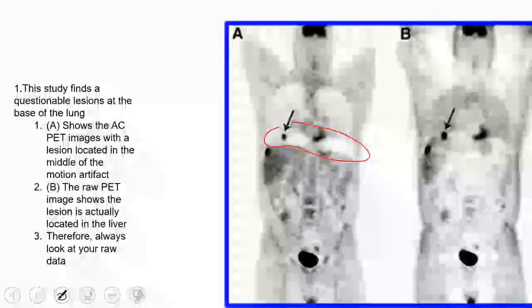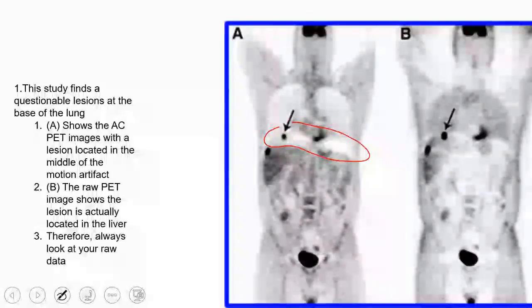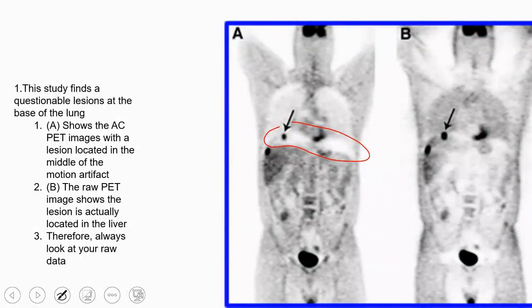There are some problems that affect the detection process for the patient. This addresses this issue in a comprehensive manner to ensure accuracy and reliability in the results obtained from the detection process for patients with similar conditions. There are some software programs that improve the breathing artifact through a specific algorithm that enhances and performs correction for the existing artifact. Alternatively, registration can be done manually. You move the CT image and work with the PET image and ask it to do this in a certain manner. Okay.